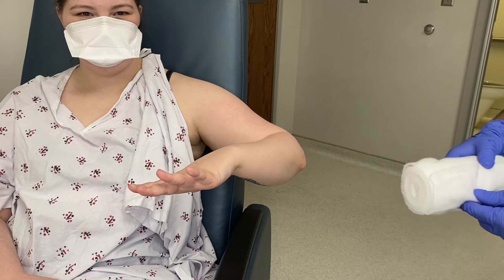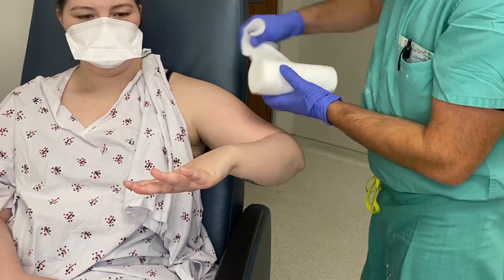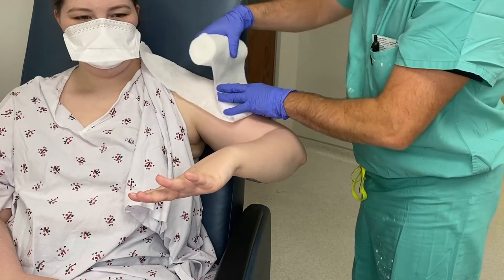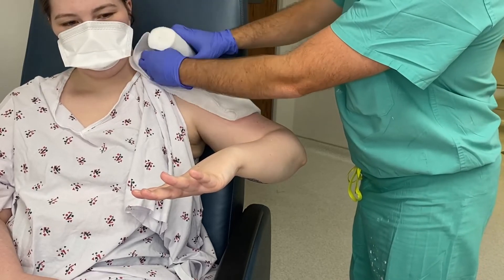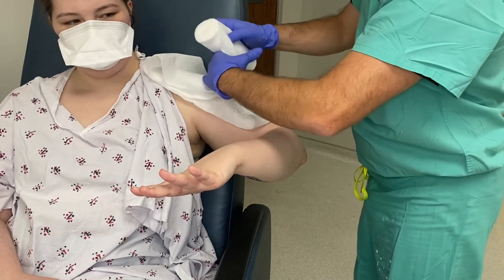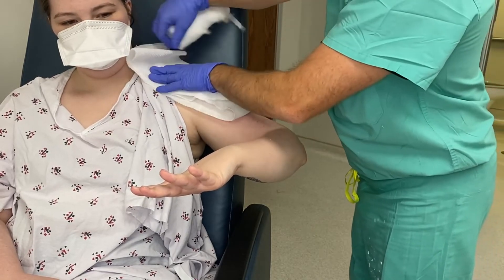Next, we have the coaptation splint. What I have is some 6-inch web roll and I will go all the way up to the neck, come about halfway down the humerus, and then fan fold this. I will do this about three times and then tear it.